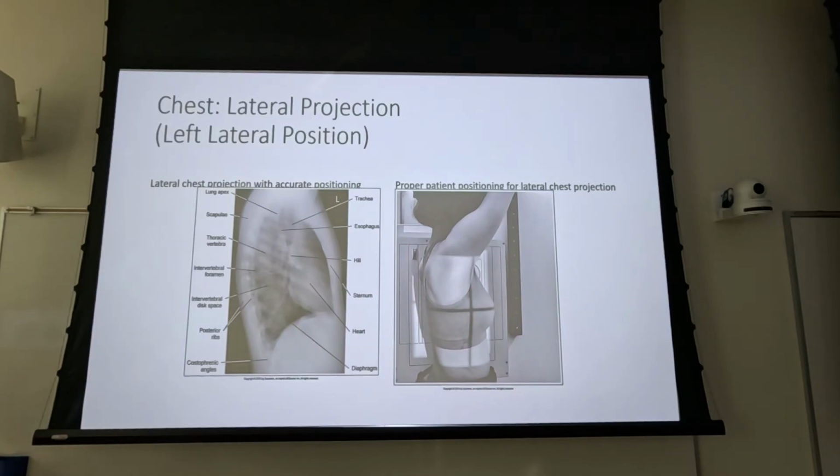You've got magnification of the upside, and divergence of the central ray may exacerbate that. So doesn't that mean that if you want a true lateral, there's going to be magnification regardless? A true lateral on our end really isn't a true lateral. You put those two things together, that's weird. Y'all are making me think this morning, but yes, potentially. Check that out. So we're done for the day. Both of those are very good points.